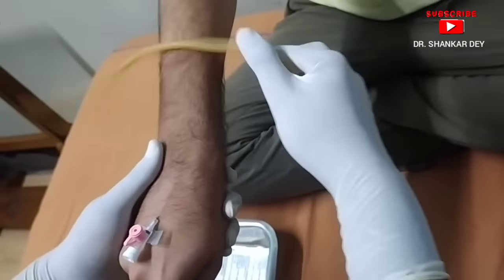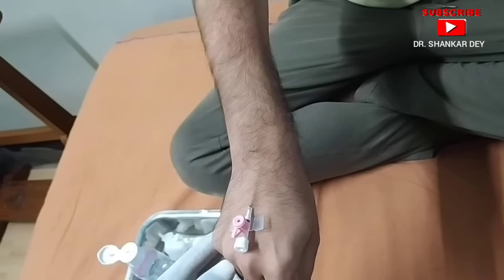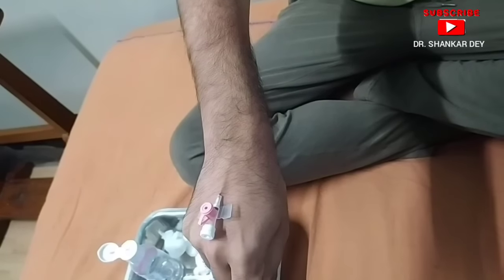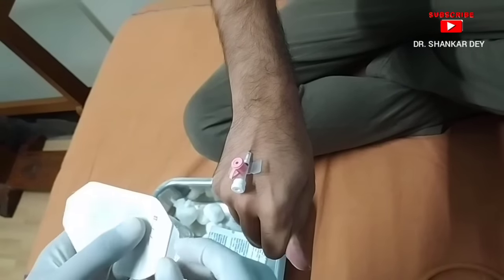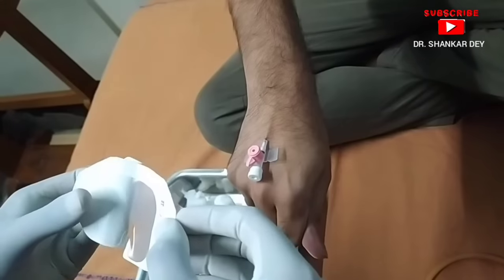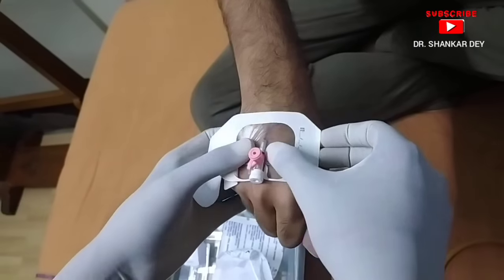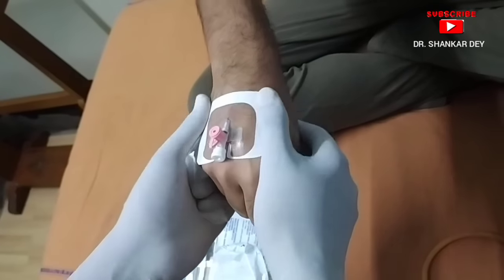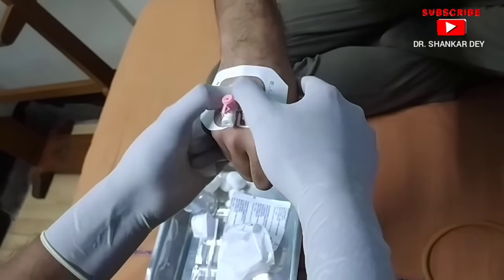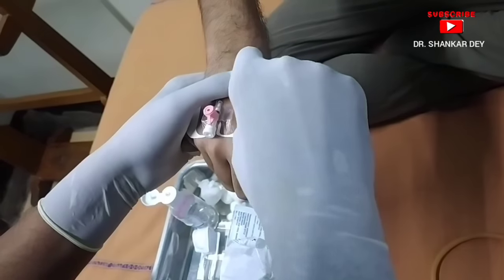Now it is time to remove the tourniquet. Next, you have to secure the IV cannula with the adhesive tape. Here is the adhesive tape — now secure the IV cannula with it. All the steps for how to introduce the IV cannula are clear. Now I am securing the IV cannula with adhesive tape.